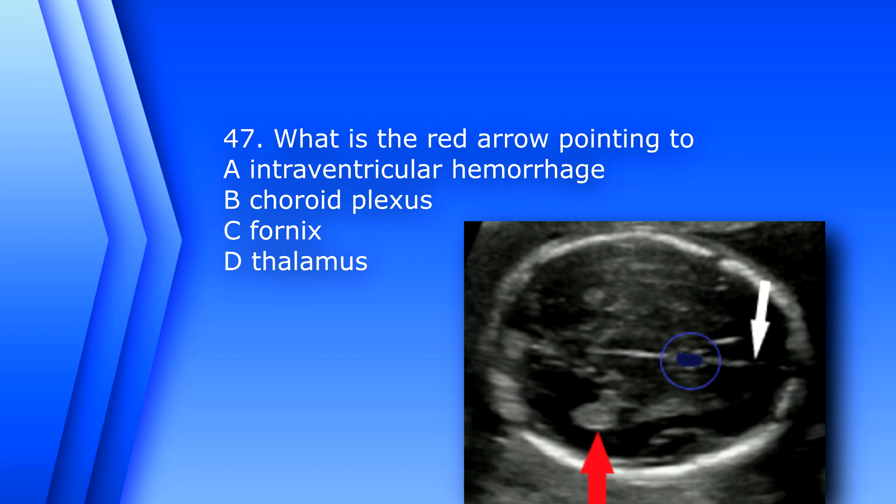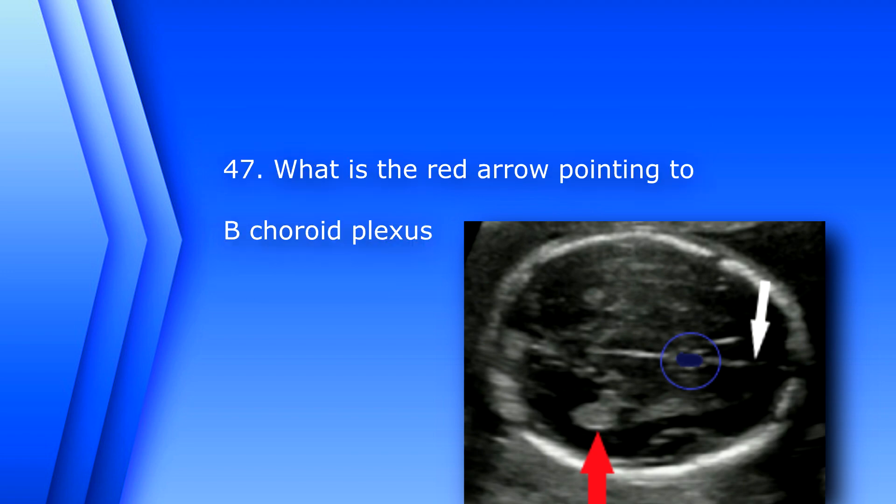Question 47: What is the red arrow pointing to? A) intraventricular hemorrhage, B) choroid plexus, C) fornix, or D) thalamus. The answer is B, choroid plexus.